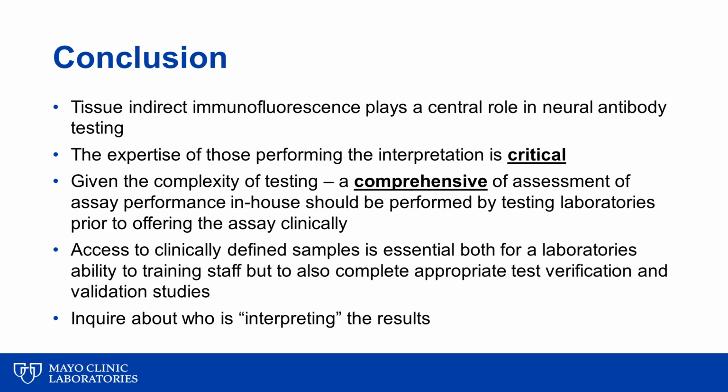Access to clinically defined samples is essential, both for a laboratory's ability to train staff, but also to complete an appropriate and thorough test verification and validation study. It's always important to inquire about who is interpreting the results. The degree and the quality of the interpretation is critical to the quality of the assay.